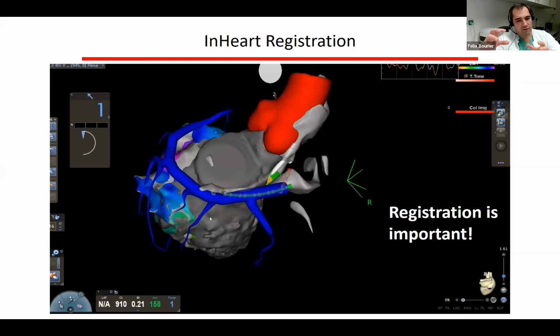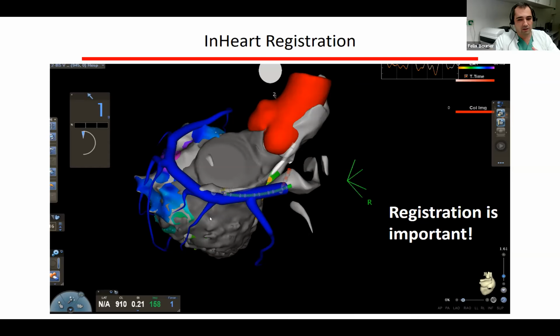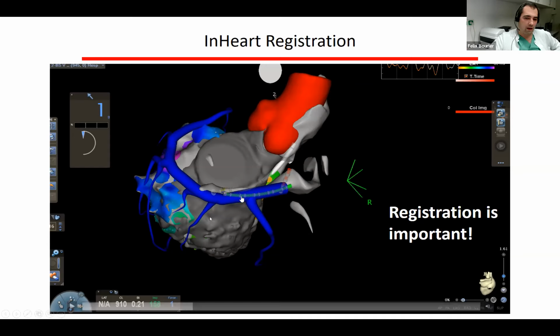And having those landmarks, you have a very high level of registration accuracy, because using those, you can align your anatomy in all 3 directions, in all 3 orientations of the space. And they are quite close to the heart itself. This means that the offsets that you will encounter are as low as possible. And what is nice about the aorta is that if you get a nice map of the cusps, you can already use those to get an idea about rotation. And same thing with the CS.